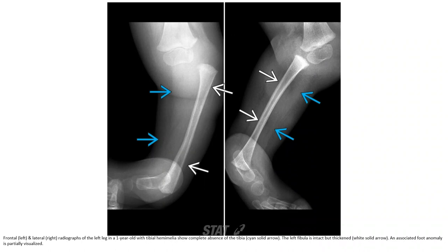This is a frontal and lateral radiograph of the left leg in a 1-year-old with tibial hemimelia showing complete absence of the tibia. The left fibula is intact but thickened, and an associated foot anomaly is partially visible.